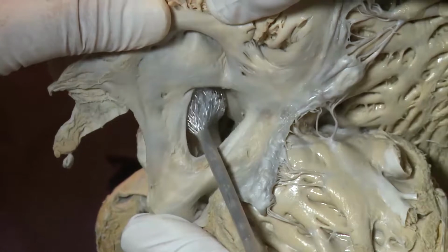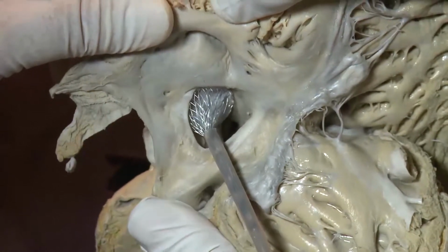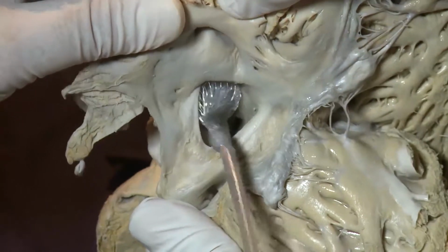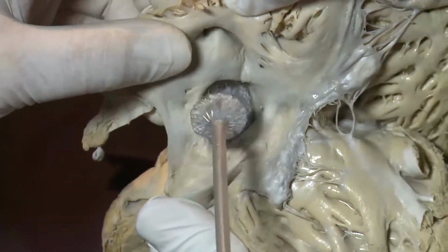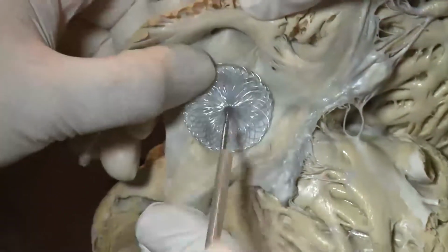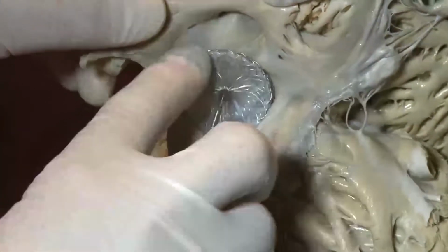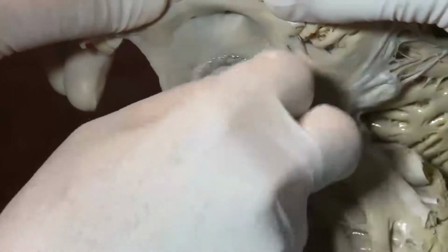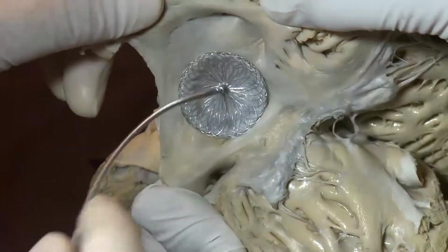It's safer, preventing the prolapse, and then open the RA disc like this. From the RA side, it's good, well aligned to the septum.